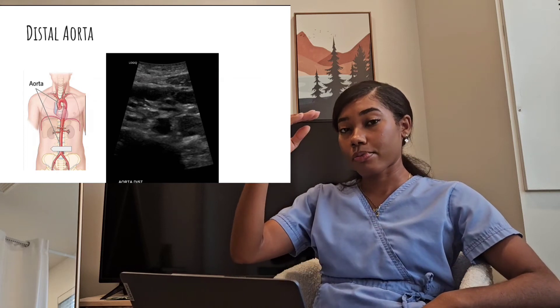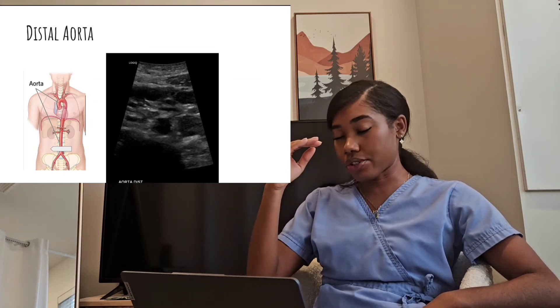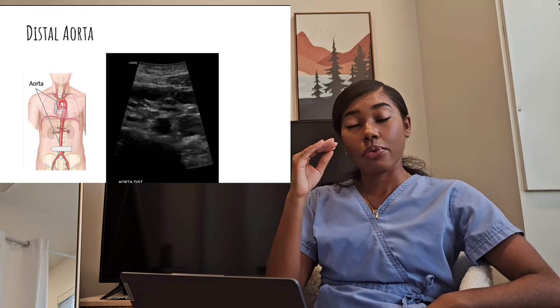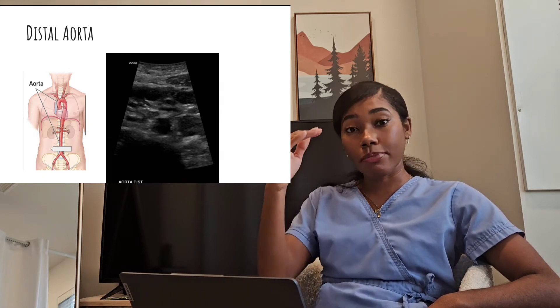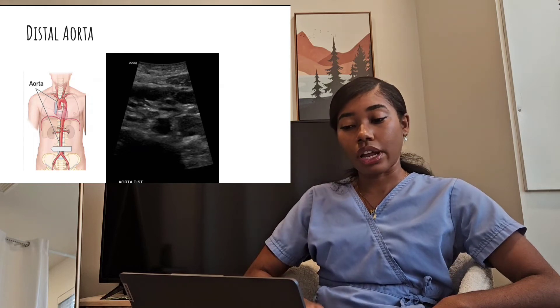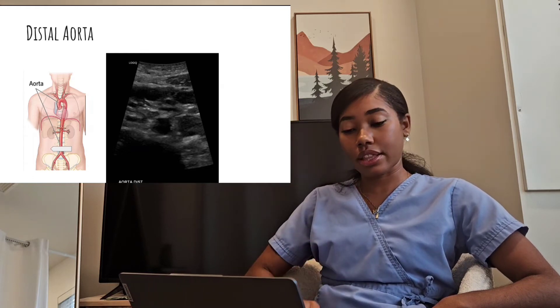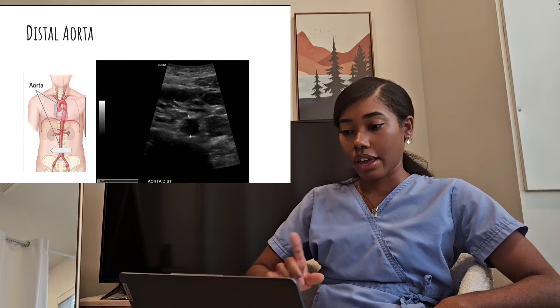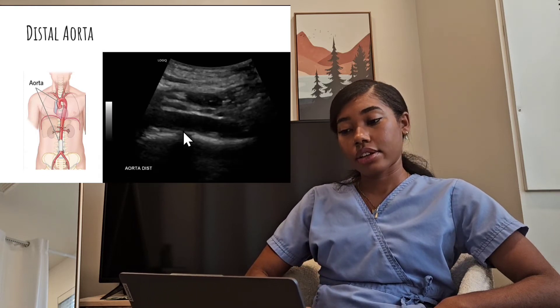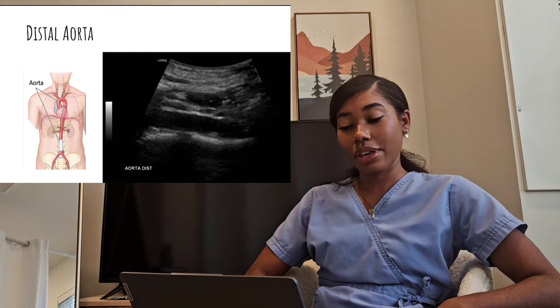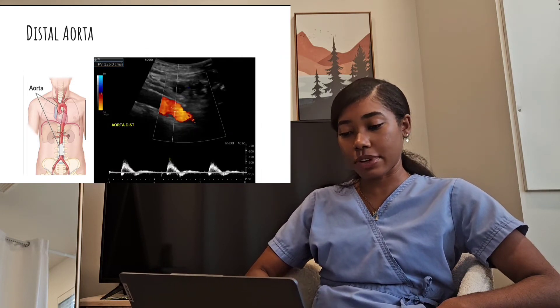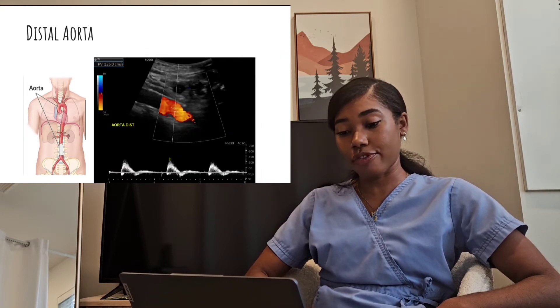Then scan back and make sure to image the distal aorta, because that's where you know you're right above the bifurcation. When you have your nice round image, take the 2D transverse and measure anterior to posterior, also take a longitudinal image, measure anterior to posterior again, and take your spectro-Doppler waveform.